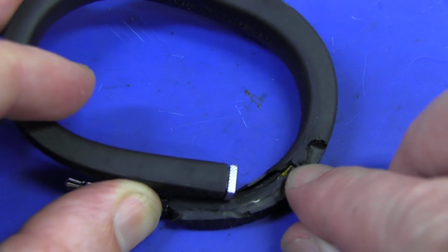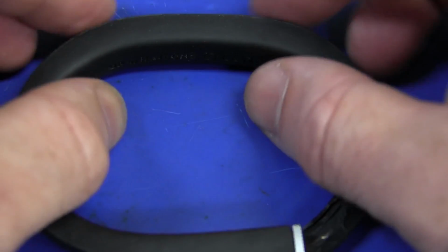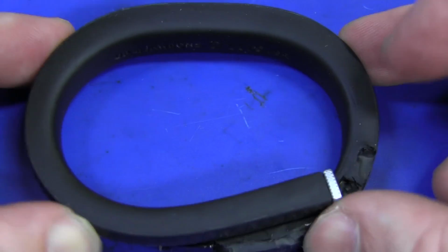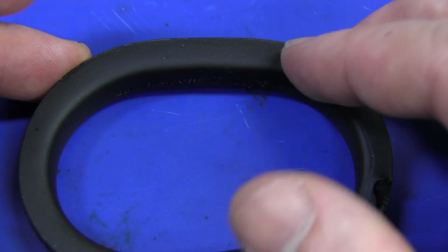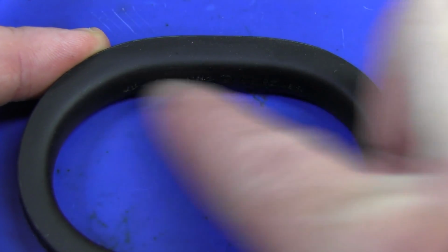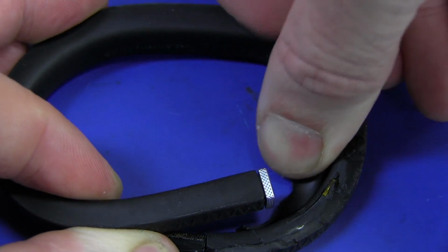And I'm slowly getting into it in there, and you can see the metal spring bar in there. So of course the whole thing has to have a spring metal bar in there, and my guess is the battery, or the battery and maybe all of the circuitry, is down on this stiffer bottom bit down here, because there's probably a flex PCB going right through this thing, of course. You can get flexible batteries these days, but I think it's just all going to be bound up down in there like that, perhaps with maybe some components going off to the sides. I don't know, but yeah, gotta go right around this thing and crack it open.